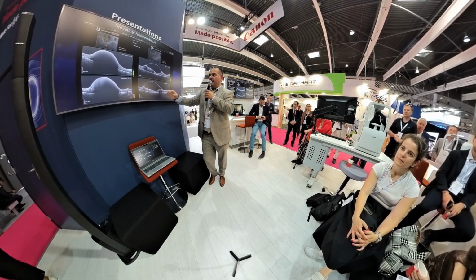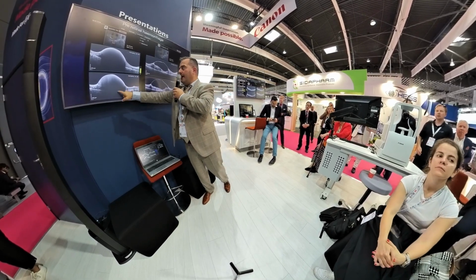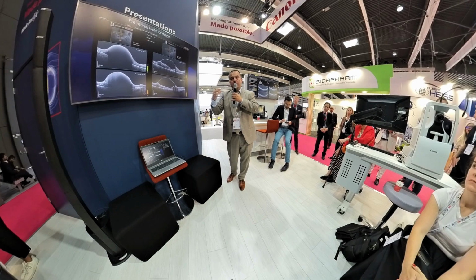And albeit the low level of the signal, it still can distinguish between the blood, lack of signal, and the retinal morphology, meaning that the image is correct anatomically.